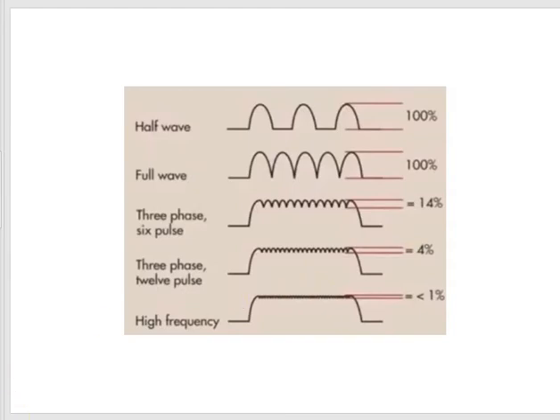That is how three-phase power supply is made an optimum power supply to an X-ray tube.